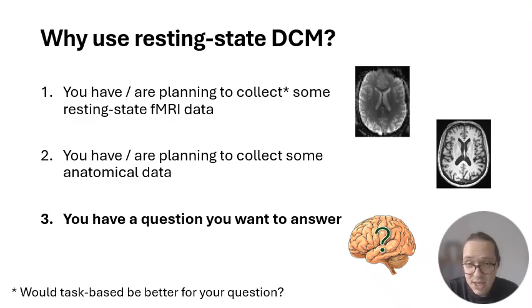However, it might be the case that your hypothesis is one that relates to resting state or doesn't require people to do a task. It might be the case that you are working with a clinical population or group of people who find it hard to perform tasks in an MRI scanner. Or it might be the case that you already have some resting state data collected and want to try and do some dynamic causal modeling on it.